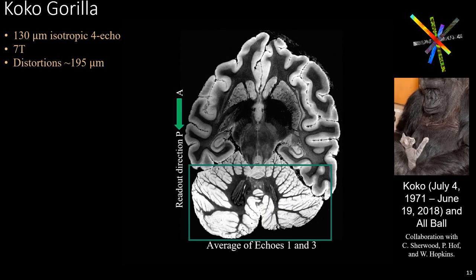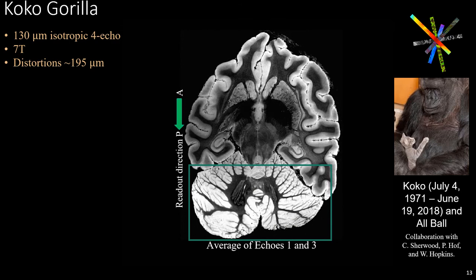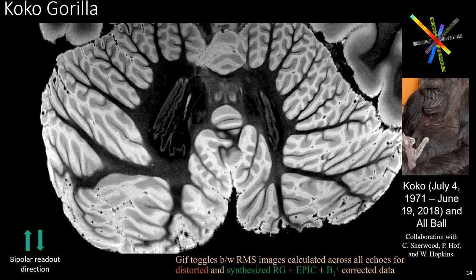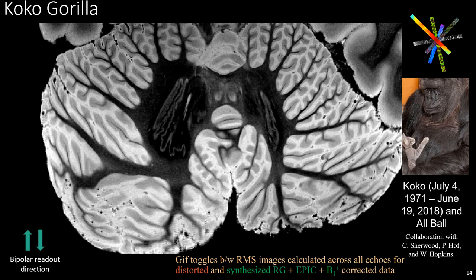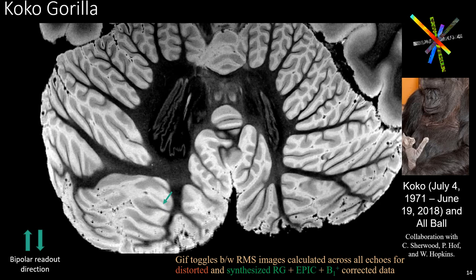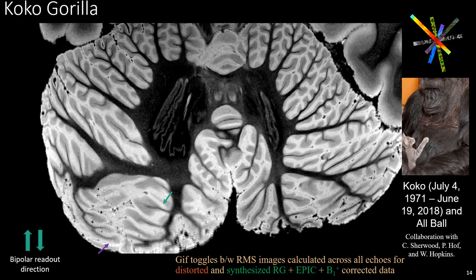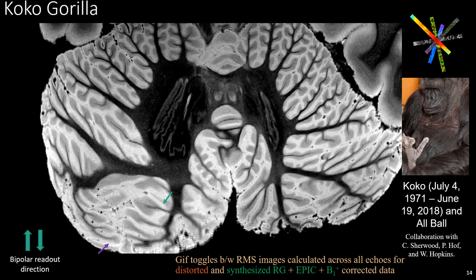We present results of an ex vivo gorilla brain scan at 7 Tesla with 130 micron isotropic resolution. Zooming into the cerebellum, where we see large distortions, the animation toggles between the root mean squared images calculated across echoes for the distorted and EPIC corrected data. EPIC successfully aligns the branches and corrects distortions as small as 195 microns, and also removes blur in the leaves of the cerebellum. Additional B1-plus correction was applied to further improve the contrast.